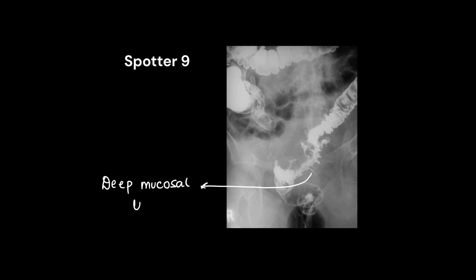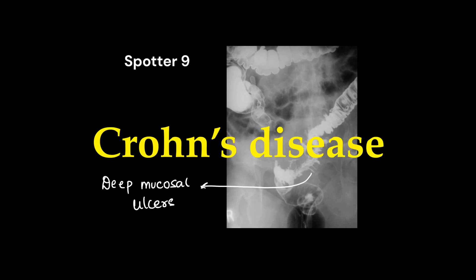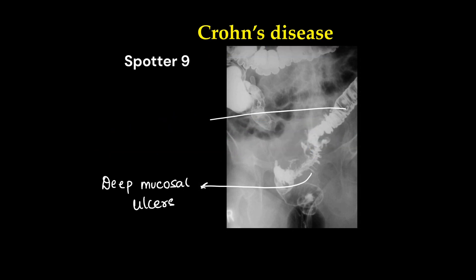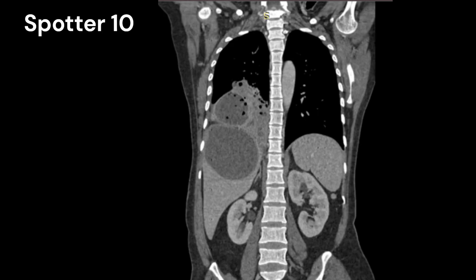This is inflammatory bowel disease — that is, Crohn's disease. Here we can see deep mucosal ulcers filled with barium contrast, and we can see aphthous ulcers.